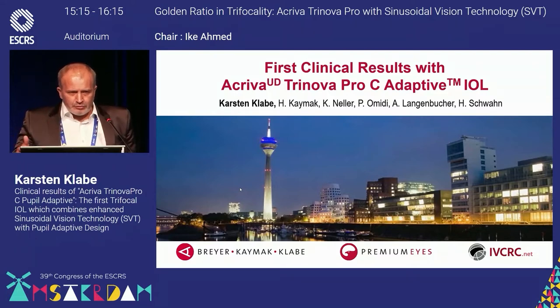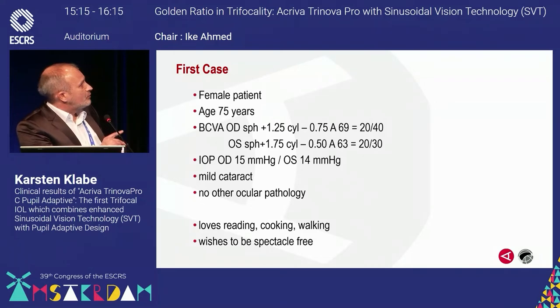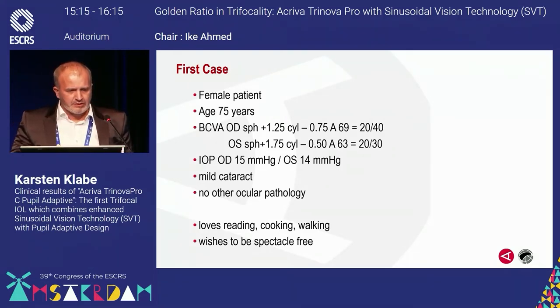We don't have a long-term outcome, but there is a tendency. So I will present you my very first case, a female patient, age 75, visual acuity 20/40, 20/30, with a mild hyperopia and a little astigmatism, normal pressure, mild cataract, and no other pathologies. She loves reading, cooking, walking. So what we expect from a perfect grandma. And she wishes to be spectacle free.